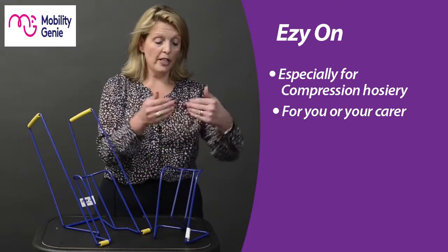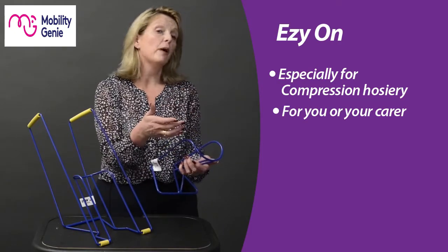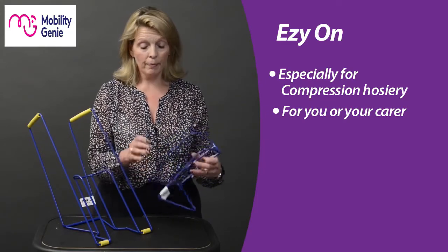The small is a great carer's aid. Simply load the compression hose in, slide it down, and then turn it around to help your loved one ensure that they get their compression hose on safely and easily without needing to bend.